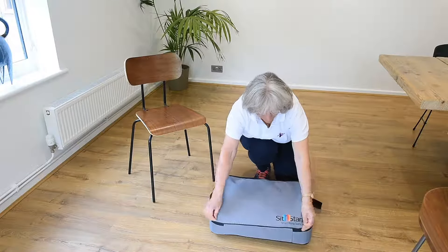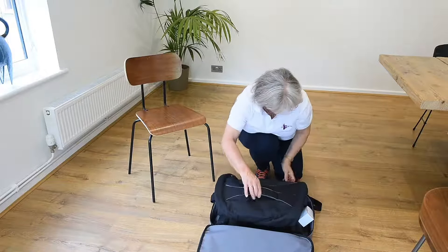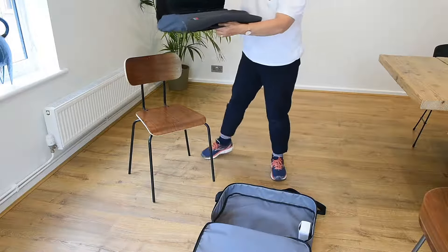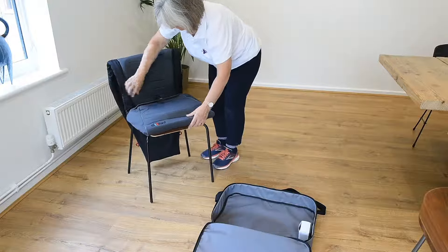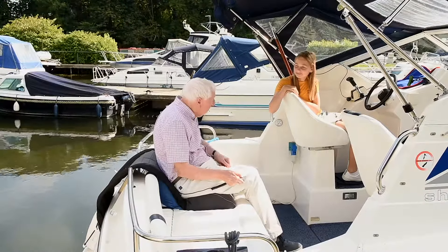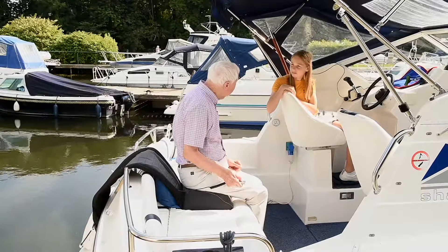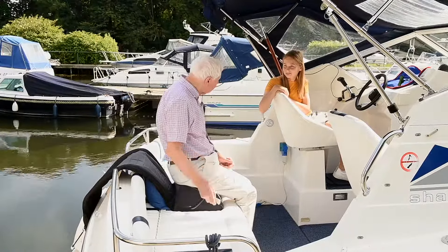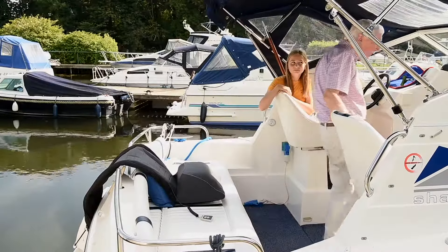The SitnStand comes with a carry bag so it can be taken anywhere with you. The product is cleverly designed and uses a battery and air compressor as a counterweight to the seat. The SitnStand promotes purposeful occupation, encouraging the client to engage in activities that they choose to do.